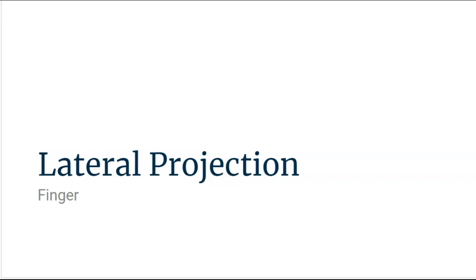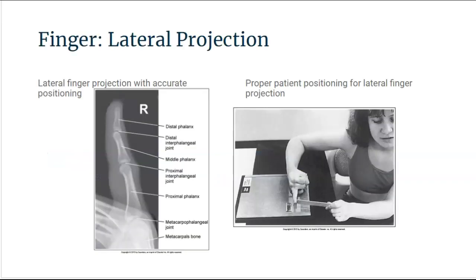Moving on to the lateral finger projection. Image analysis guidelines state that there should be no overlap from the adjacent fingers. The anterior surface of the middle and proximal phalanges should demonstrate mid-shaft concavity, and the posterior surface should show slight convexity. More than twice as much soft tissue width is demonstrated on the anterior surface than the posterior surface, and the interphalangeal joints are demonstrated as open spaces.